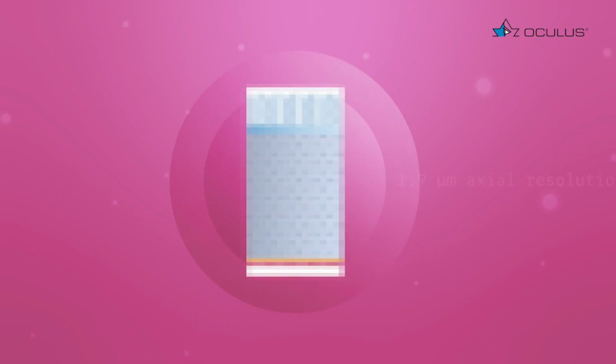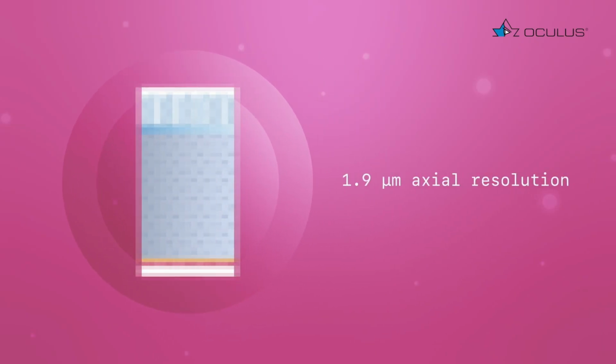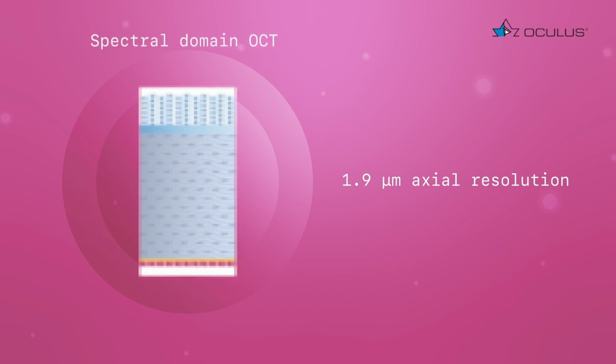So we have a spectral domain with a large broadband, 200 nanometers bandwidth. This gives you the ability to see a lot of information and to have the detail. And I see the processing is getting better and better. And this is going to help us to identify things that we don't know.